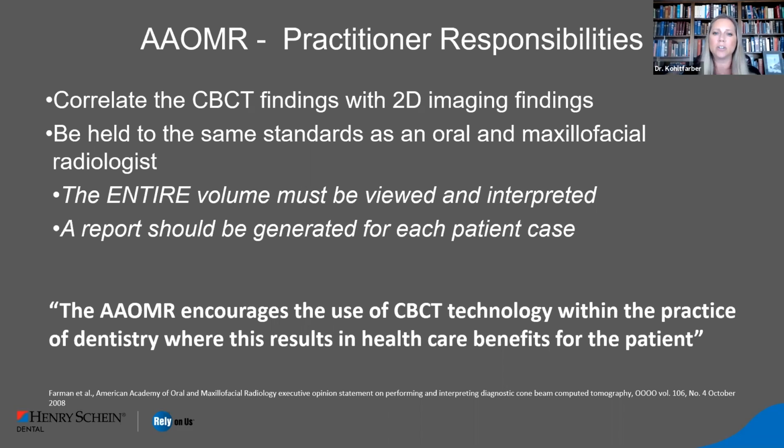Many times we're so eager just to look at the mouth that we key in on the area and the reason that we took the scan, and we forget to look at all of the other area. It is important to look at things globally first, evaluate the entire scan, and then come down to the reason you actually took it. And the reason for that is we do find a lot of other incidental findings in our patients. It's important for us as dentists because many times we're catching it before the medical professionals. It's important for us to be able to point that out to the patient and send them where they need to go.